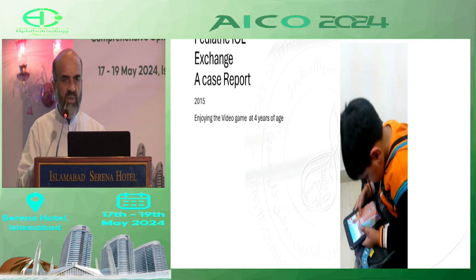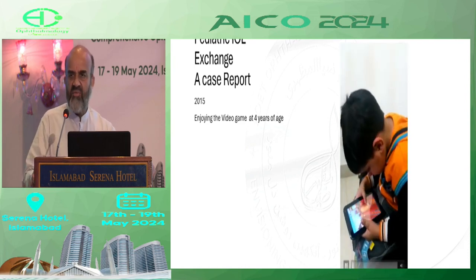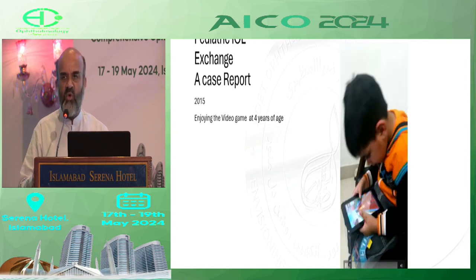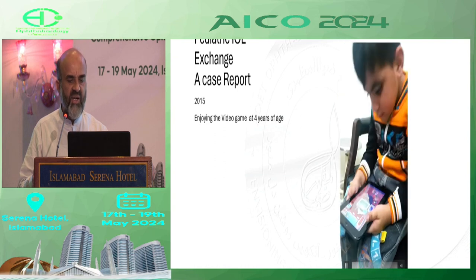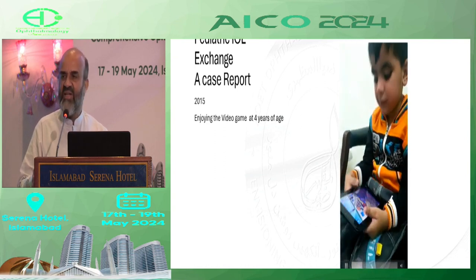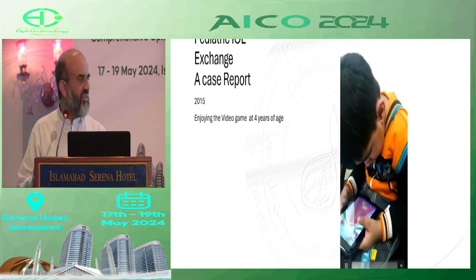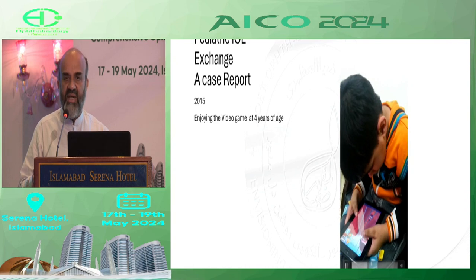And he was implanted in 2011, and this video was recorded in 2015. And he was about -4 at that time in one eye and -6 in the other eye. And he is enjoying video without any glasses because it lies in his far point. And that's the reason he did not get amblyopic.